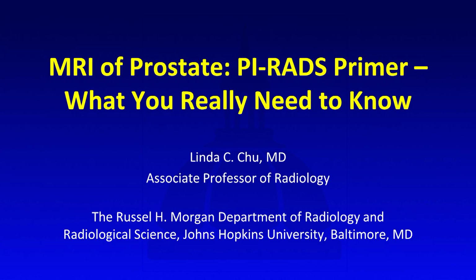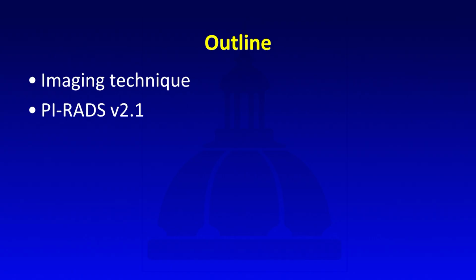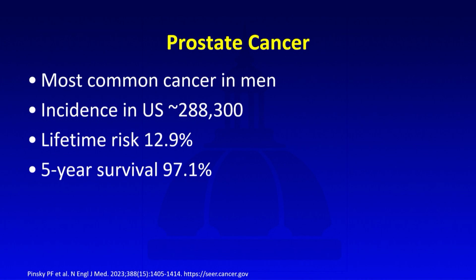Just a show of hands, who is reading prostate MRIs in the audience? Okay, so a lot of you. So hopefully I still managed to bring some new information because I'm trying to go through the basics and then to the more complicated. But hopefully everyone can get something from it. So again, as per usual, I'll start with the imaging techniques and then go over the PI-RADS version 2.1 in detail with lots of examples.